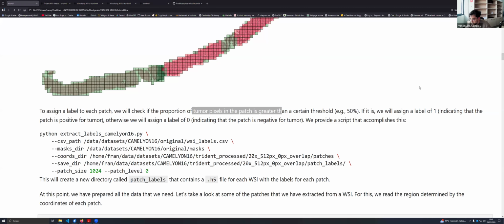Okay. There is another question. From your experience, given a foundational embedding network, how many whole slide images are required to get a decent performance using multiple instance learning? Let me discuss this later, because I want to highlight again the importance of the foundational network. So let me answer this later.